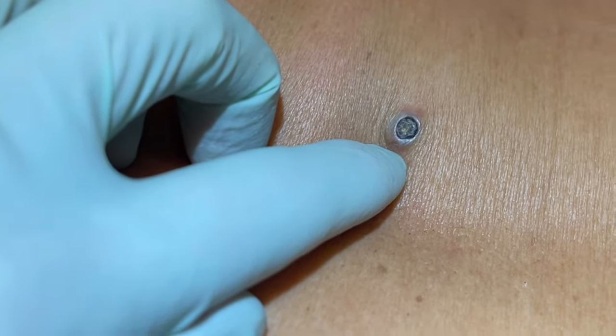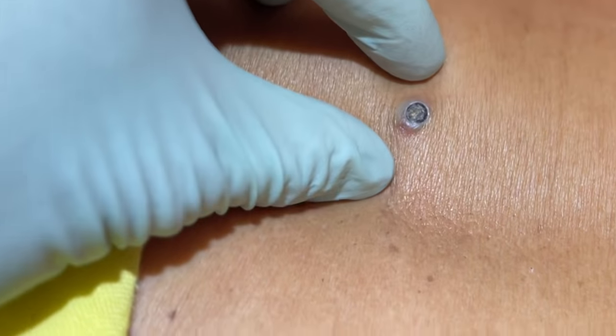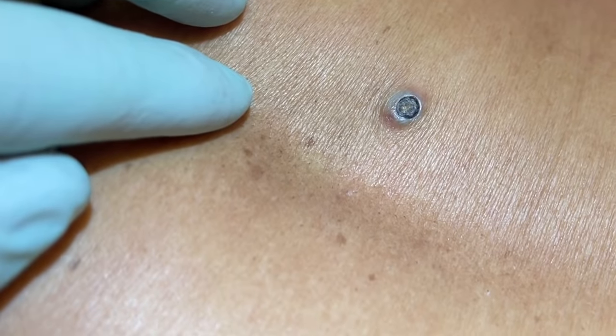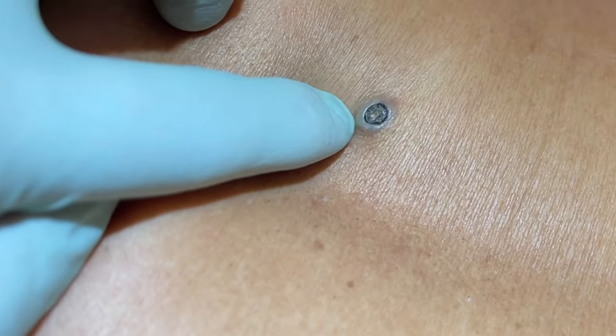And that should kind of close up with cautery, so we'll get that taken care of today. Thanks to her for sharing her procedure so we can see how to properly remove a large blackhead.